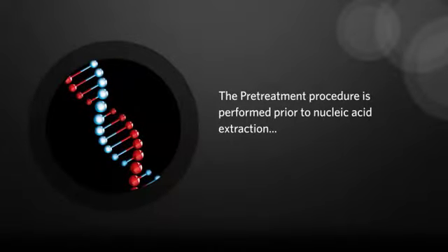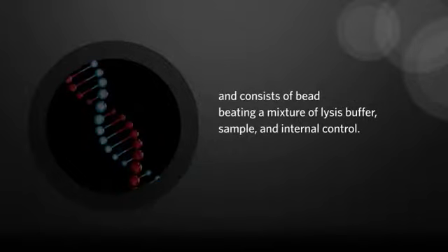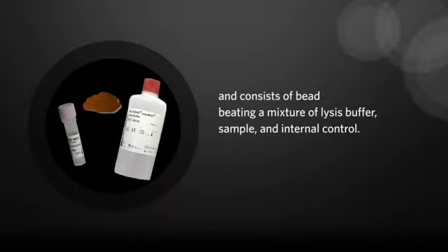The pretreatment procedure is performed prior to nucleic acid extraction and consists of bead beating, a mixture of lysis buffer, sample, and internal control. The pretreatment step is essential for proper sample preparation.